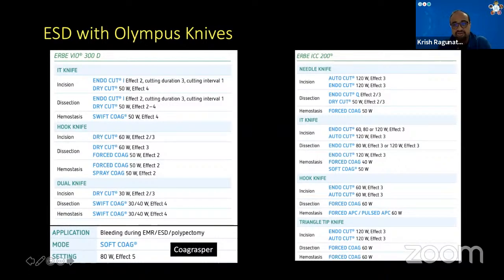And these things, as you know, have been evolving over the years, how it was started and what settings were used, and we keep learning. Almost on every meeting, people share their experience here. And what about ESD? What currents do you use for making an incision and also for dissection?